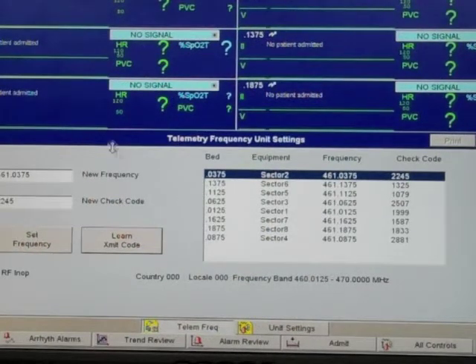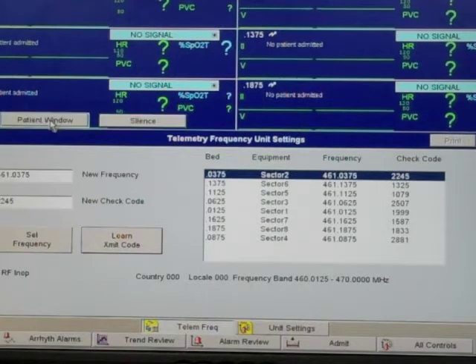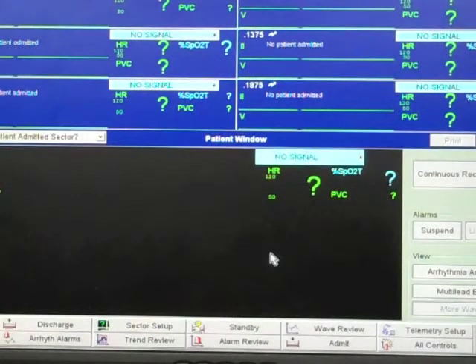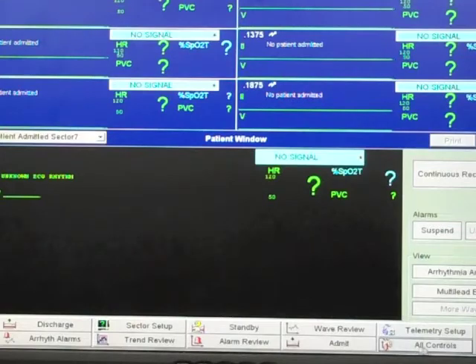Mouse over any sector and click patient window. In the lower right-hand corner of the screen, click all controls.